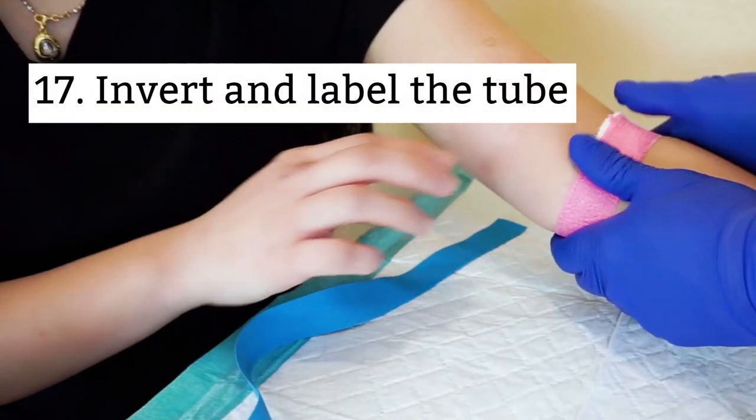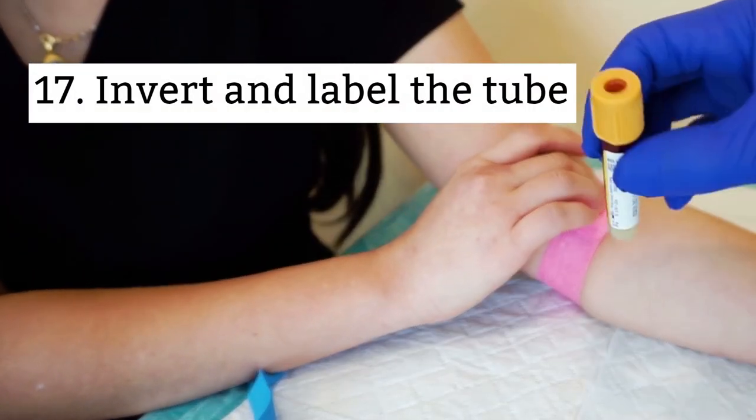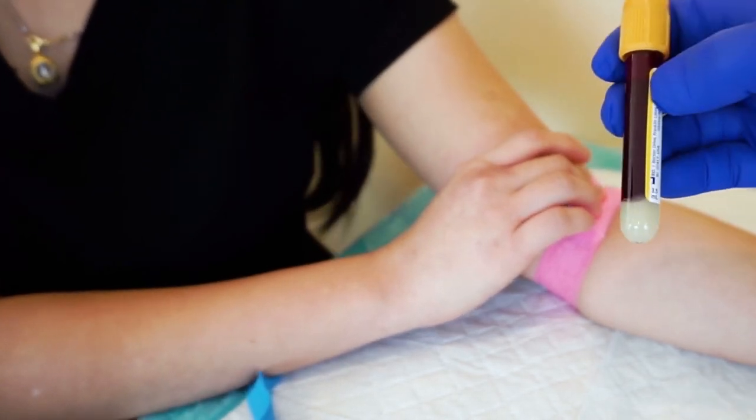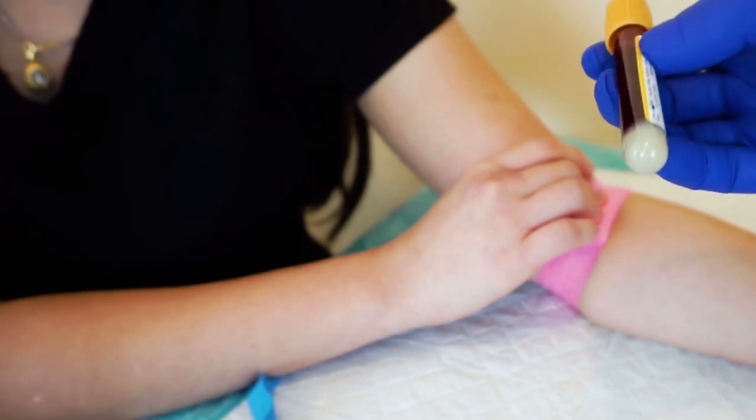Seventeen, invert the tubes a few times and label the tube with the patient's information. Generally, on the label, you should include your initials, date, and time of draw.